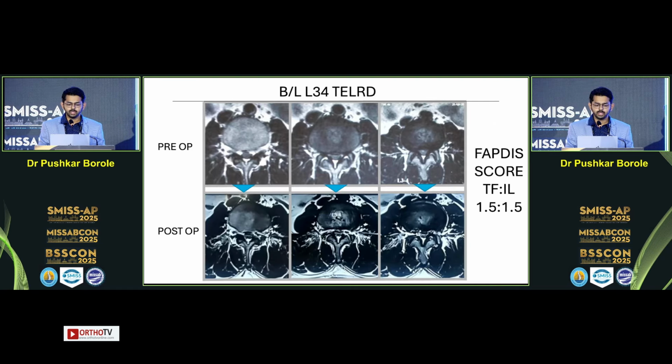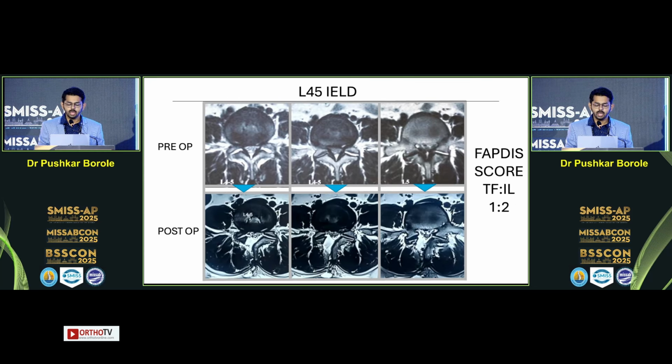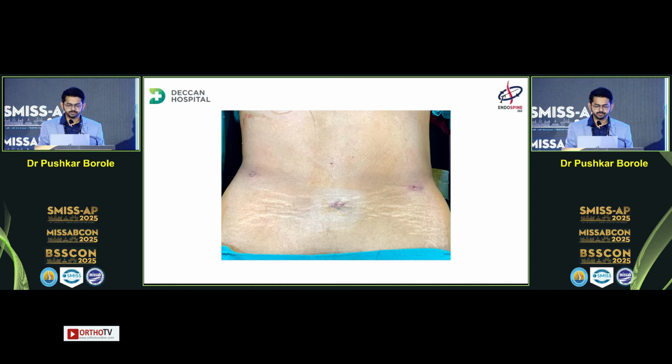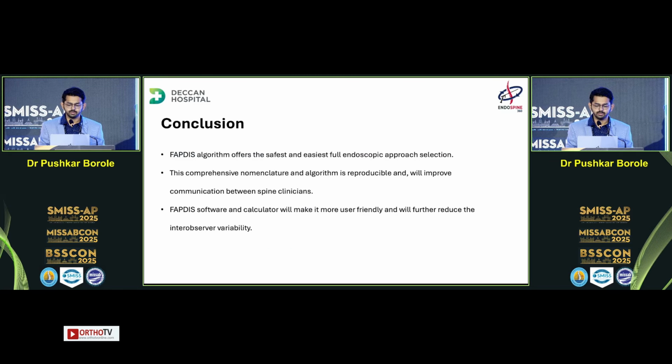So for this lady, we did a staged procedure. Bilateral L3-L4 transforaminal endoscopic decompression was done. At L4-L5, ULBD, ipsilateral and contralateral over-the-top decompression was done. And discectomy was done for L5-S1 on the right side. This is the clinical picture.